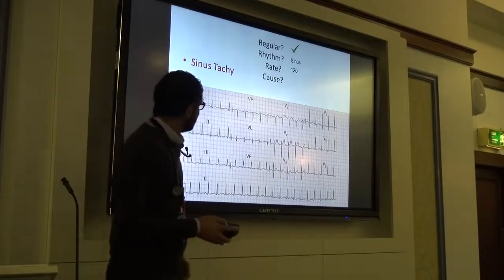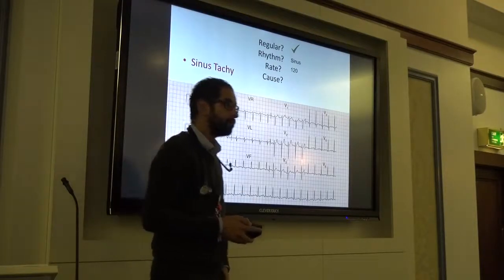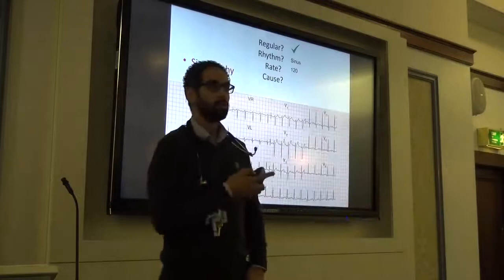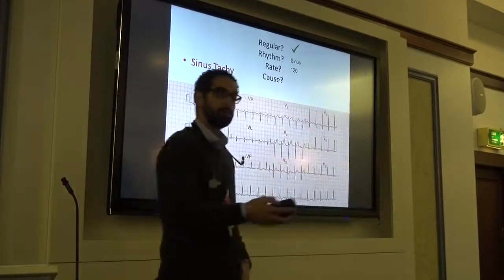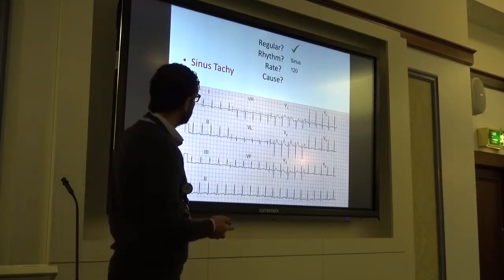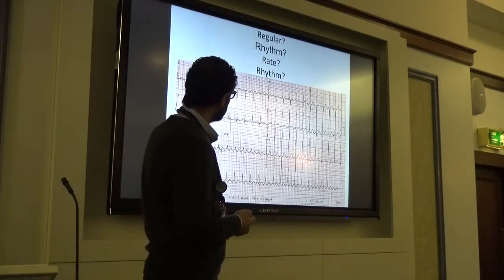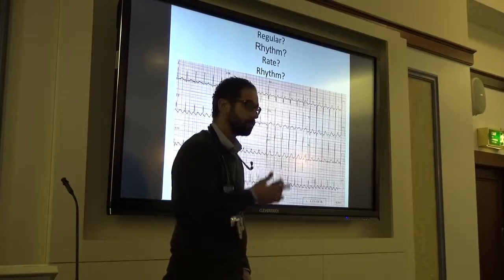So what could cause sinus tachycardia? Exercise, excellent. Pain. Caffeine. Infection, so you'd see this a lot in A&E. Sepsis, trauma, anemia. All right, good. Thyrotoxicosis, great. Is this regular? Yeah, very good. And what's the rhythm here? We said it's regular, so what's the rhythm?